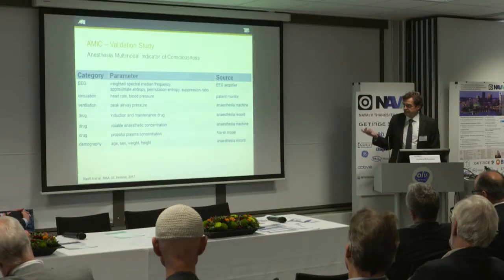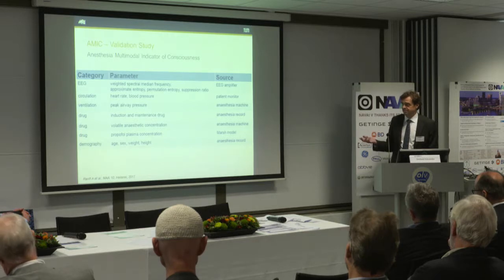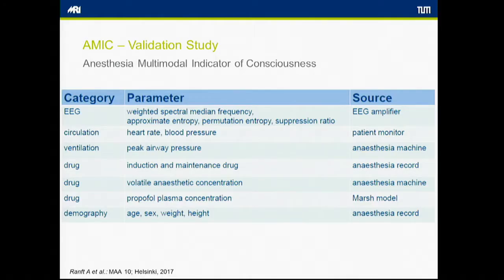These are the parameters which go into it. So it's an EEG-based parameter analysis. There's information about heart rate and blood pressure, about ventilation, drug information, calculated plasma concentration of propofol, volatile anesthetic concentration, and demographic data as well.